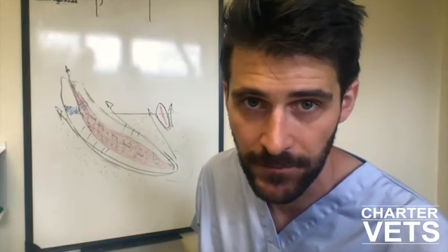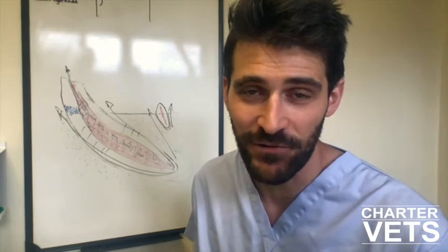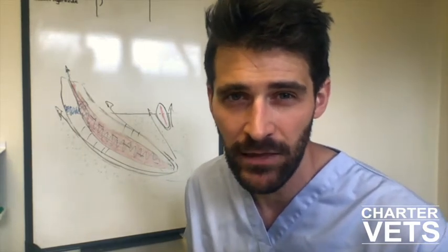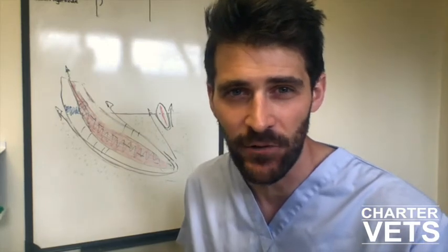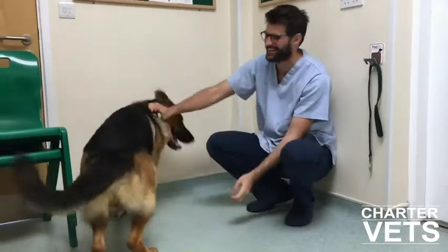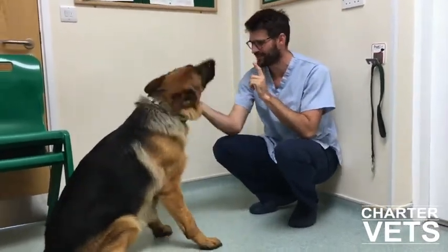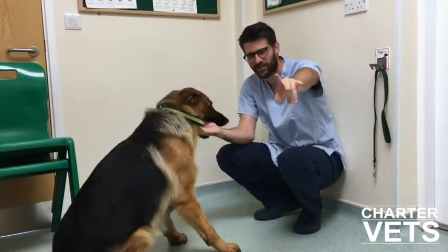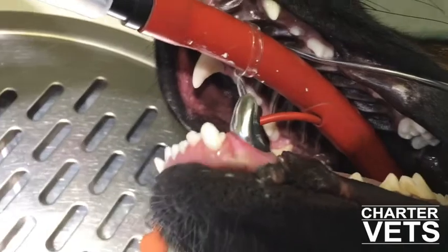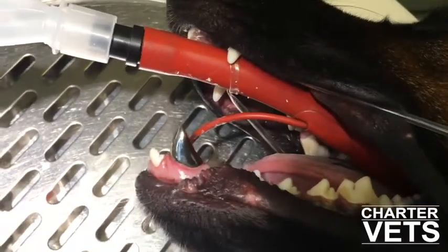which does weaken the structure somewhat, but we needed to do that to get the pulp out and to cleanse the tooth properly. But Rufus, finally, has also shown us some form with doing daft things with his teeth. His dad lovingly calls him Rufus the Doofus, and so he may continue making daft decisions with what he does with his mouth. So placing a metal crown over the top just shores up my handiwork and reduces the risk of further fractures on that tooth there.